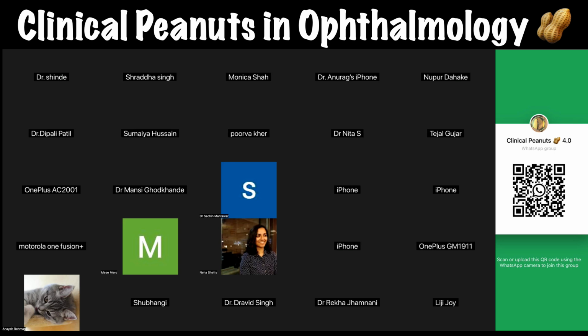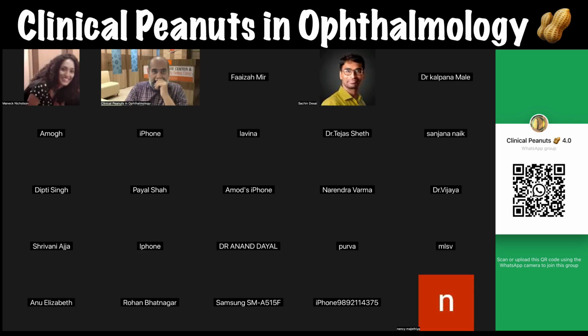I have a couple of doubts. Suppose for a beginner cataract surgeon who doesn't have access to an IOL Master 700 or even a good topographer, can we rely on our refraction and the auto keratometry, the auto ref values we obtain from that, to calculate the toric IOL parameters?